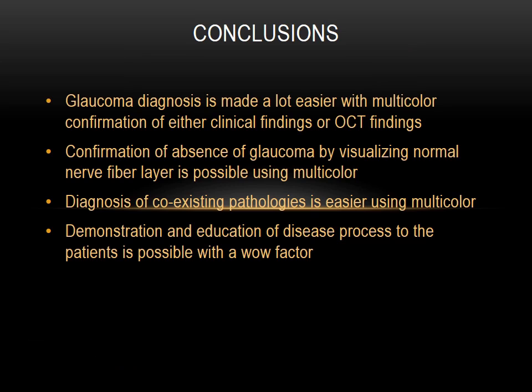So in conclusion, glaucoma diagnosis is made a lot easier with multicolor confirmation of either clinical findings or OCT findings. Confirmation of absence of glaucoma by visualizing normal nerve fiber layer is possible using multicolor. Diagnosis of coexisting pathologies is easier using multicolor. And demonstration and education of the disease process to the patients is possible with a wow factor.